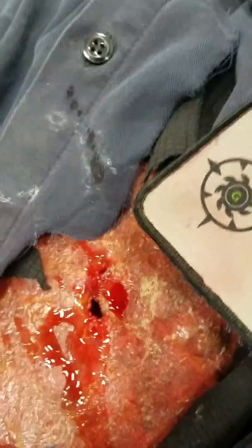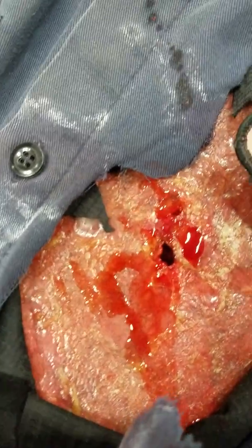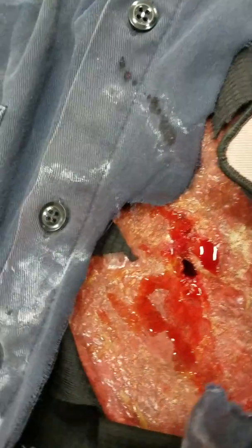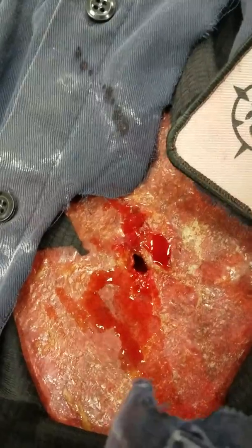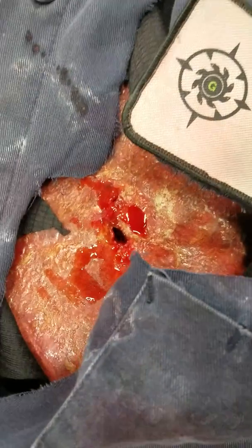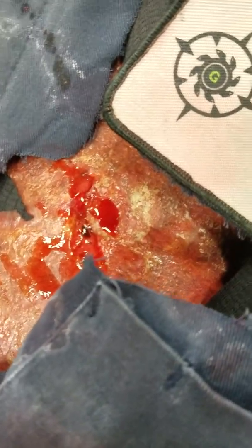Now we're going to move on to a sucking chest wound. You've got to suspect a sucking chest wound. You're going to expose the wound. What you should see here are some very telltale signs that you have a sucking chest wound. Get a little breathing in here. The sound is pretty much there. You're going to have a little bleeding. The blood may be frothy. Typically, to do it properly, the sound will be more along the lines of something like this. Got a little bit of frothy blood there coming out of the wound.